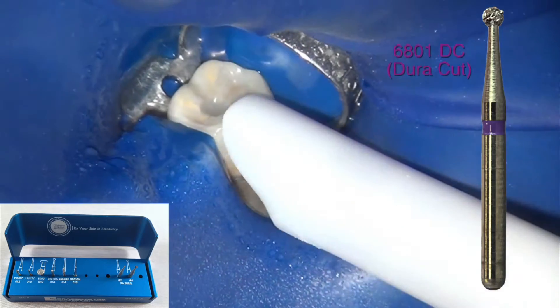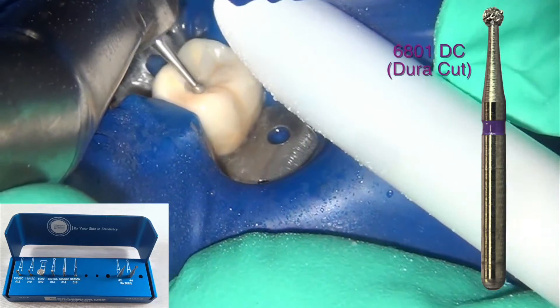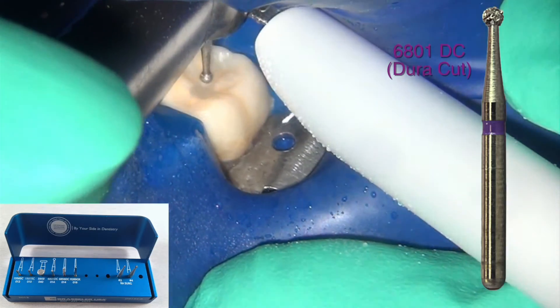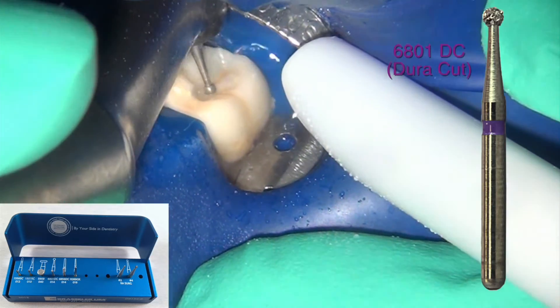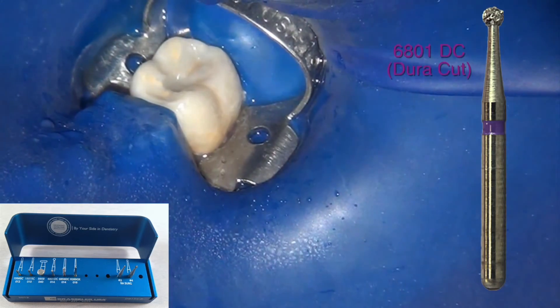It's very important that the surface of these materials stays cooled the entire time. If you see any sparks flying off or any discoloration, you are not using this burr — or whatever burr you are using — correctly. As soon as you generate sparks and heat, you risk damaging the crown that you are hopefully planning on saving, which is why you are accessing through it.